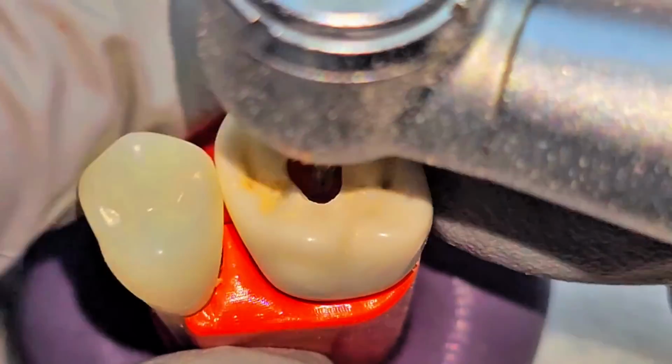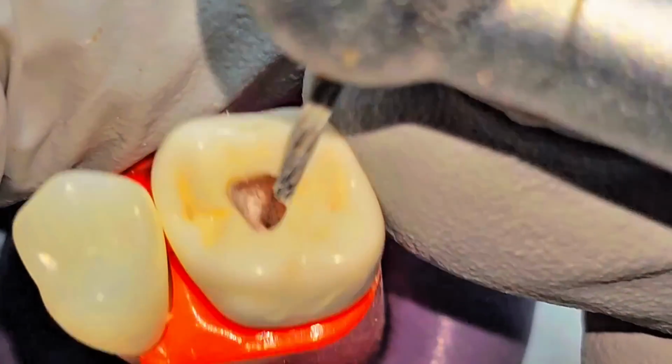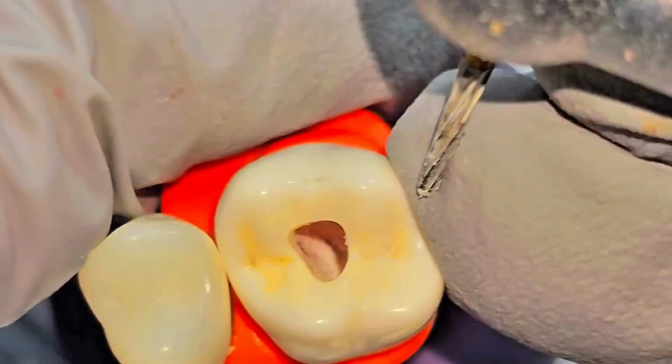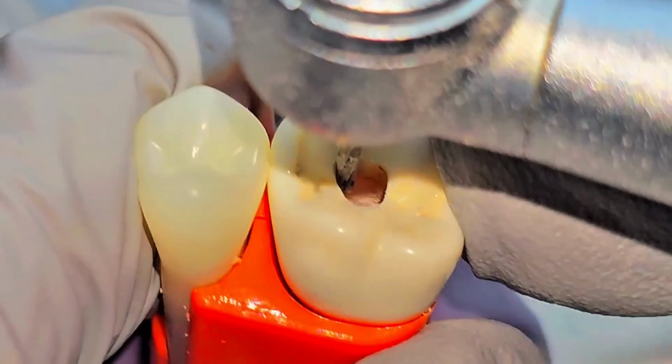Better in shape. So at this point, I'm not going at the full depth, but I'm just going to touch the surface, because when you look at it, if it is triangular, then it looks good.